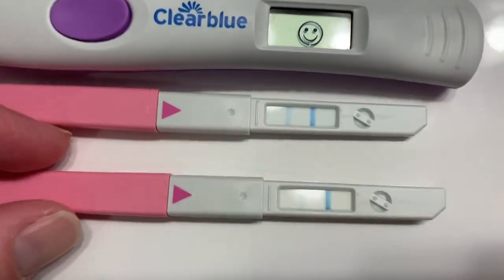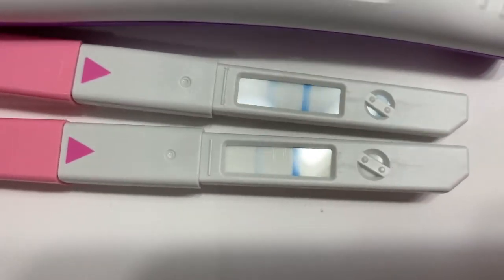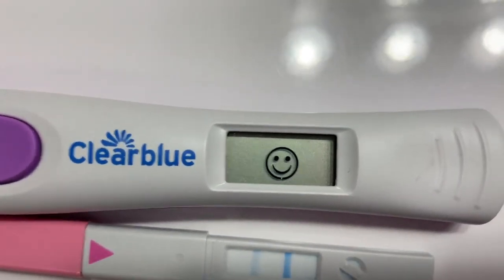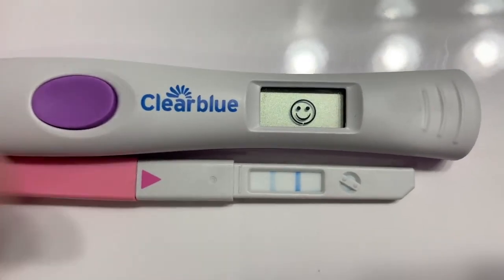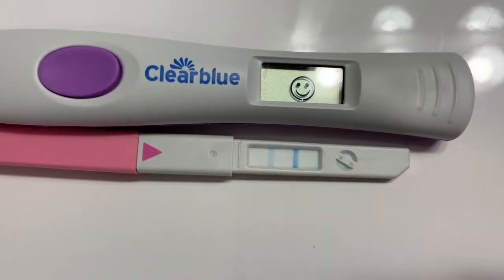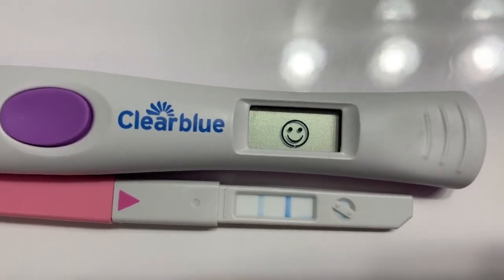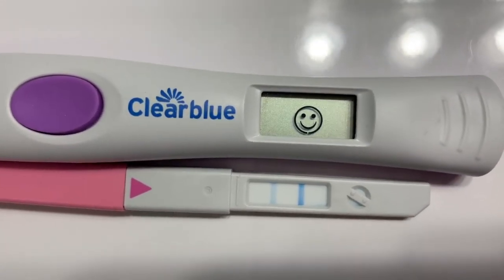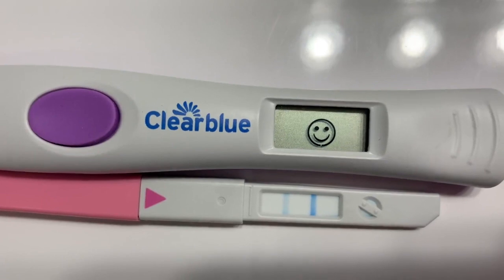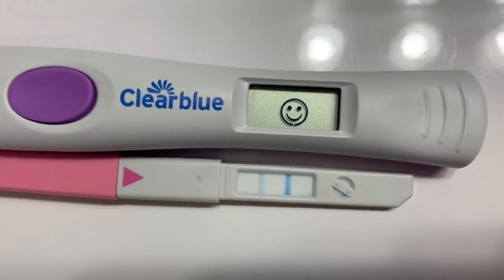And then look at this, 2 o'clock this morning. They're both light. Look at how they don't look far off from each other, but the face doesn't lie. So I have to inseminate tonight, which is awesome, because today's cycle day 11. So hopefully tomorrow's ovulation day. At least it should be, which is cycle day 12, which is wonderful and normal, because usually it was always 13 in the past. And so what's one day early, right? Oh my gosh.